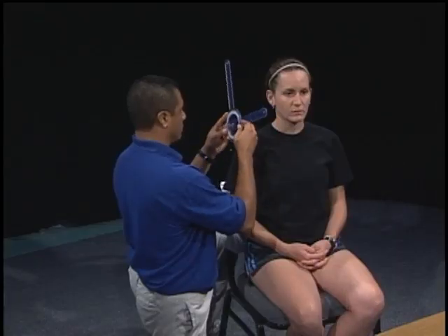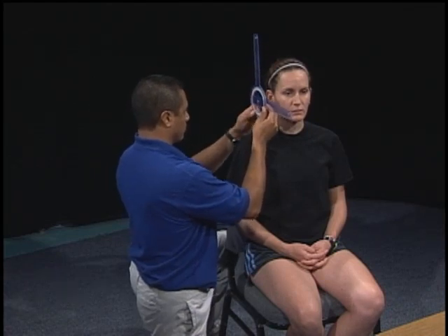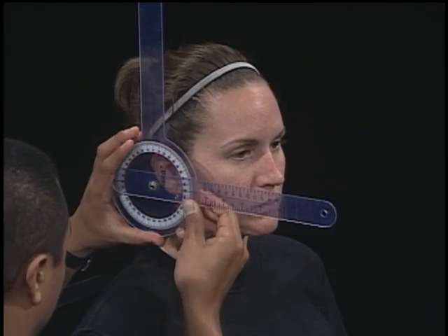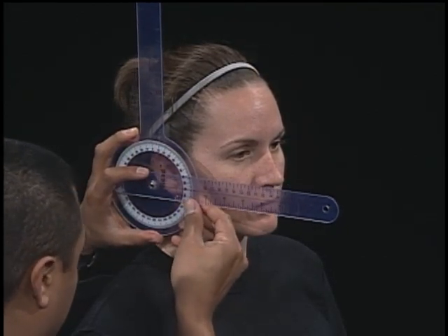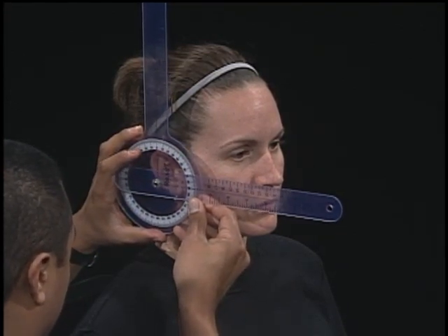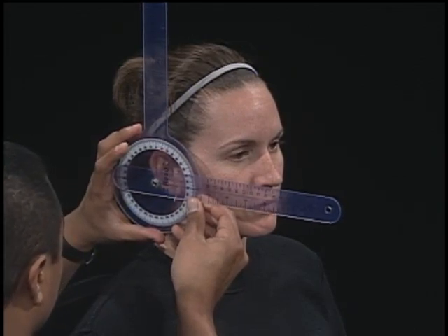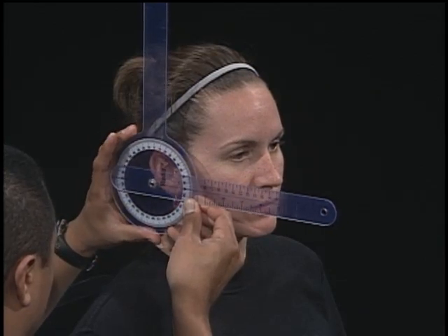You're now ready to measure the joint range of motion. Make sure you expose the bony landmarks you will be using. Align the axis of the goniometer over the external auditory meatus. Align the stationary arm so that it is either perpendicular or parallel to the ground. Align the movable arm with the base of the nares. If a tongue depressor is used, align the arm parallel to the longitudinal axis of the tongue depressor.